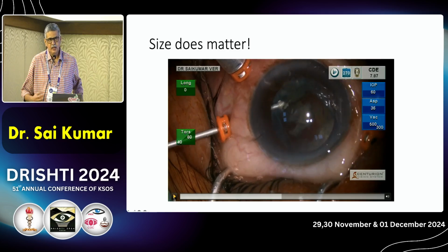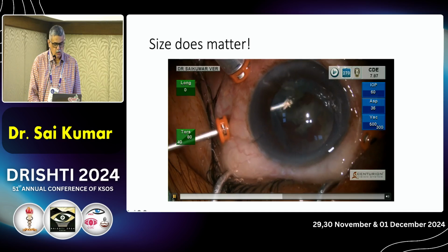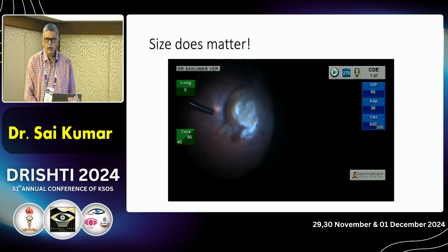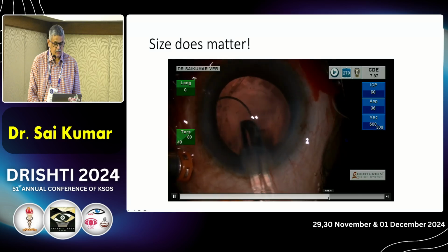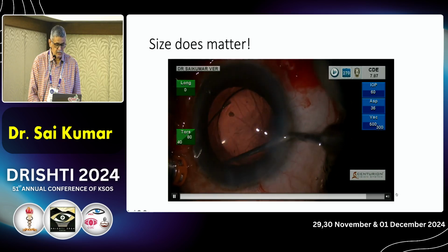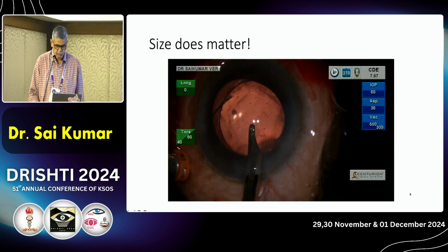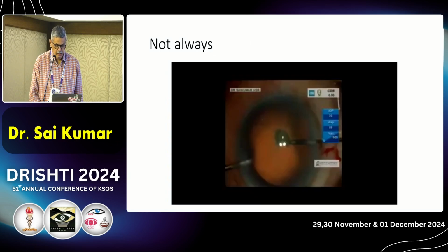I think this has been emphasized many times for all of you. But the moment it drops to the mid vitreous and you have this feeling that somehow I'll take it out, you'll end up in a lot of trouble. So make sure that you call for help. Here I have my VR colleague who comes in and takes out all the pieces, triamcinolone, PVD, all that is happening, and then in goes the 3-piece lens, with the optic captured. So this patient actually does very well, and I have sutured the main wound as well.